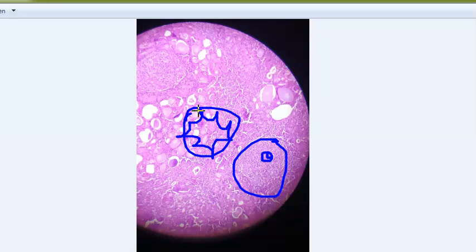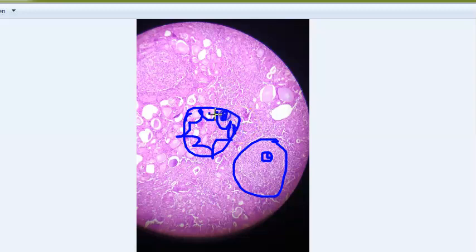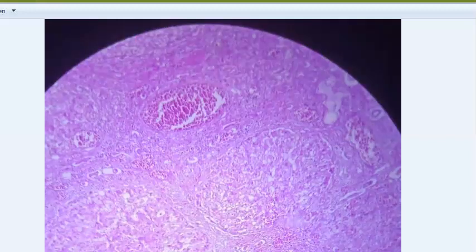In Hashimoto's thyroiditis, lymphoid follicles have germinal centers and are devoid of colloid. The follicular epithelial cells undergo metaplasia, which is called Hurthle cells - also known as oxyphilic cells, oncocytes, or Askanazy cells. These cells have a lot of cytoplasm. This is the characteristic feature of Hashimoto's thyroiditis.